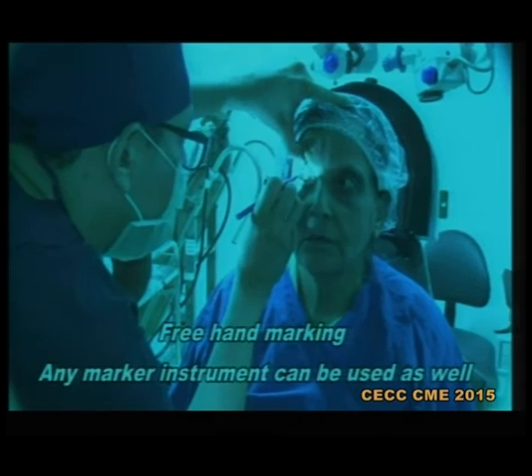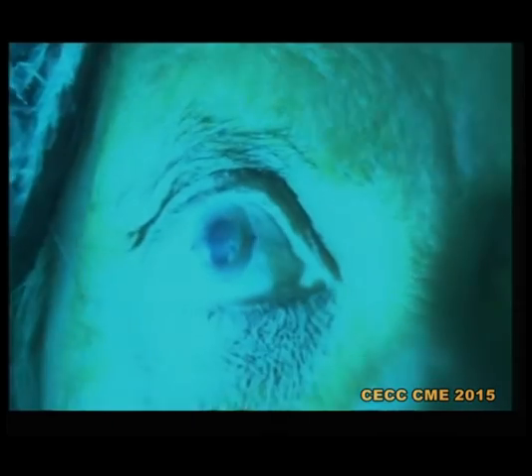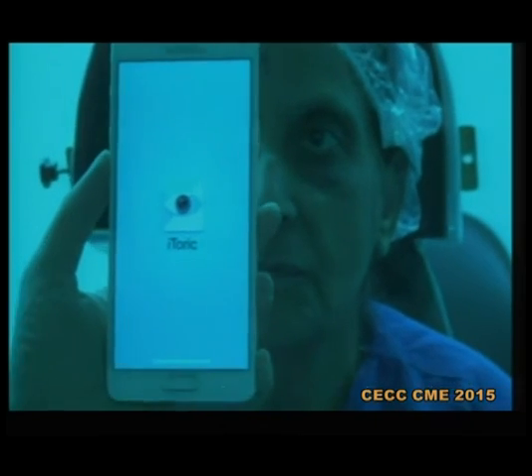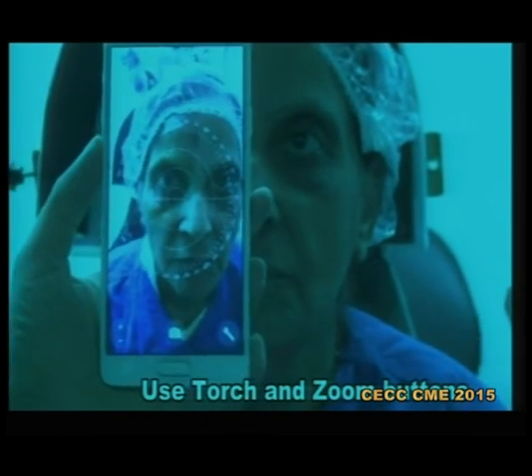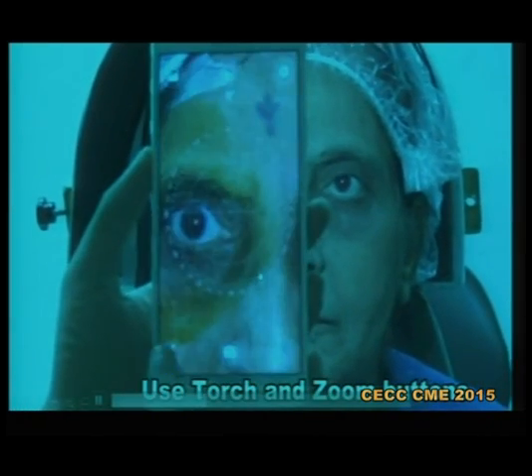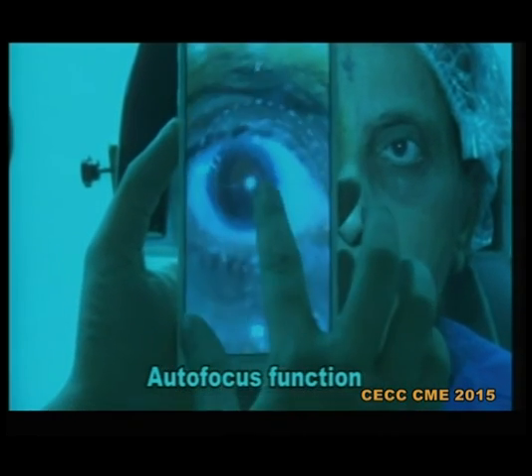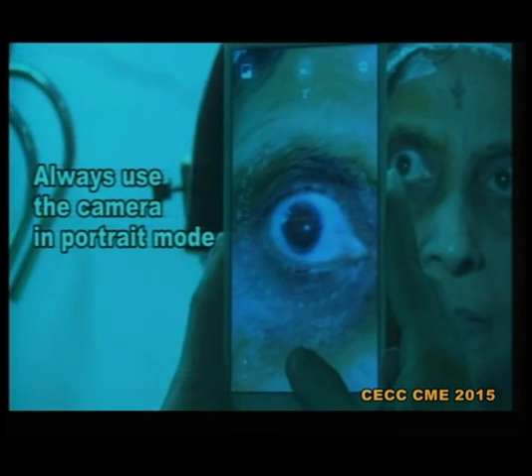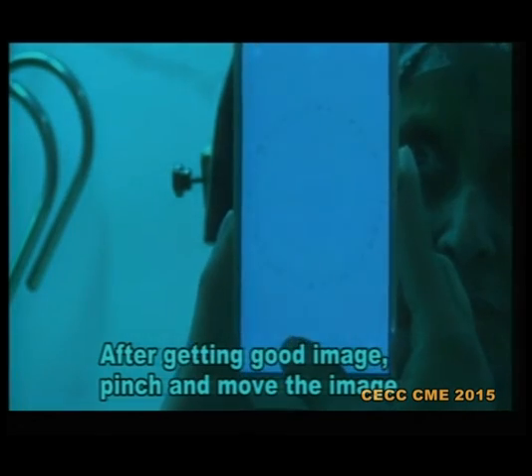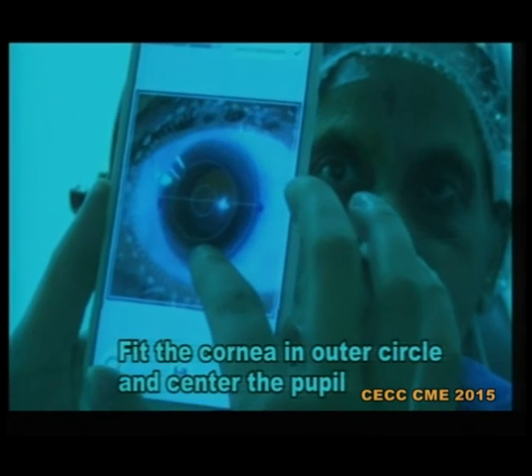The most important thing is that the patient has to look straight. In this particular video you can see she is looking a little upwards, but you have to be at the patient's level and mark. The accuracy is not a problem because we are going to check it with the iToric application. This is how the application looks like. Once you open it, you can magnify, start the torch of the camera, ask the patient to look straight, autofocus, and take a nice picture of the marked cornea.